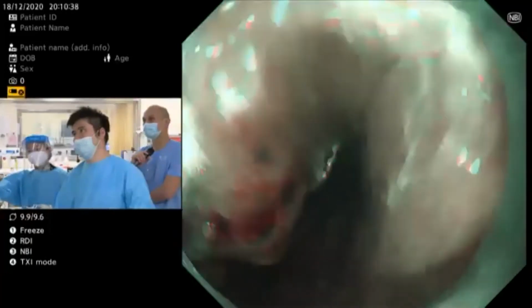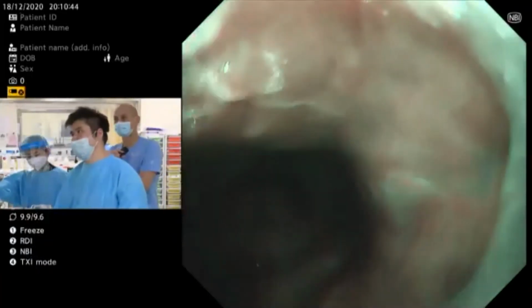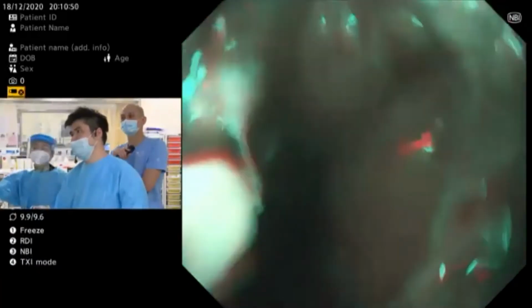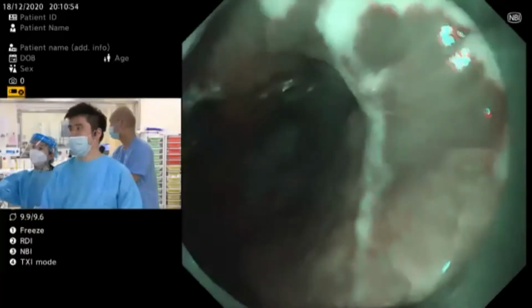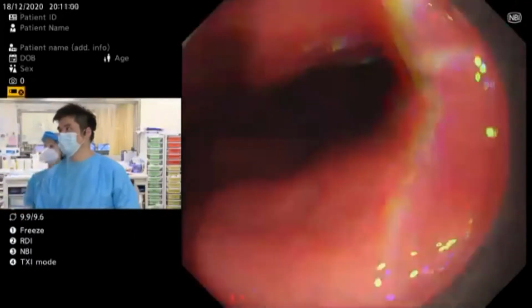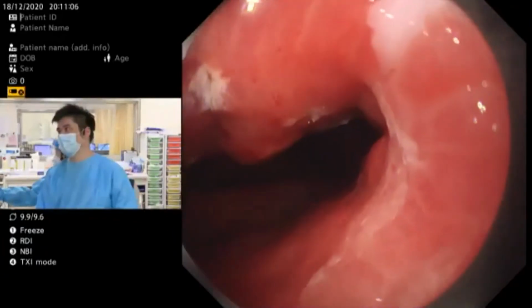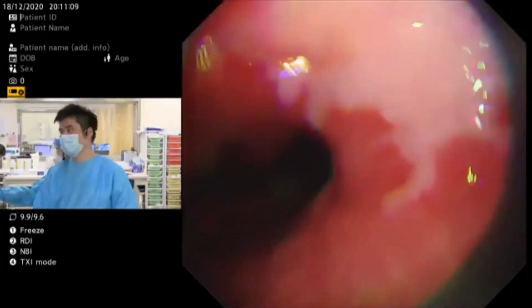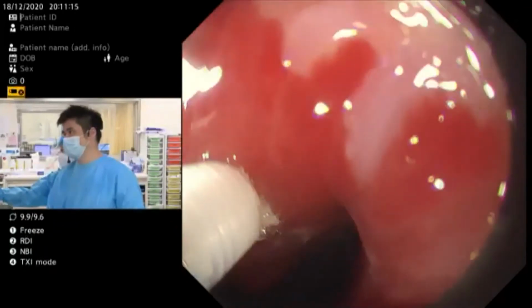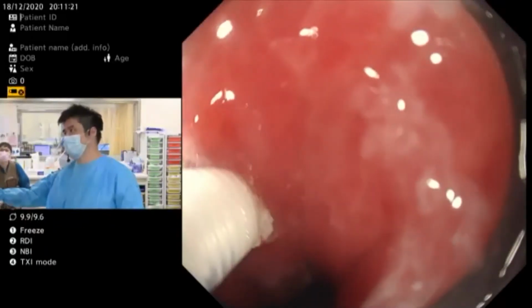Secondly, there are some studies showing that for lesions in the stomach, it's quite difficult to get a negative margin, especially if there is suspicion of cancer. I think it's because, although macroscopically you can see the lesion quite well, on pathological assessment we sometimes see that these lesions have a submucosal or subepithelial spread to nearby structures, underneath the adjacent normal epithelium. That may make EMR more tricky because the margin you get may not be as wide as you get from an ESD. But I must say this is only my personal opinion.